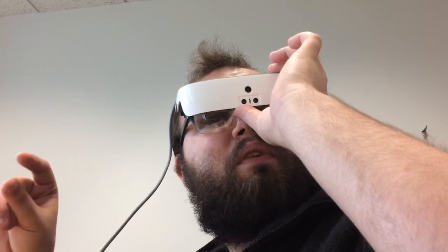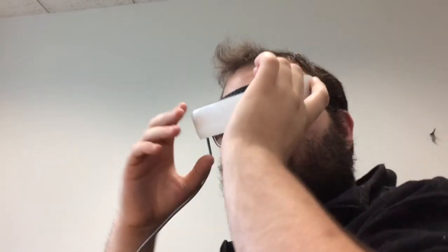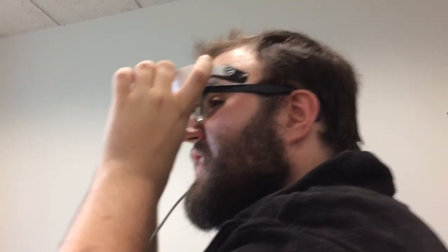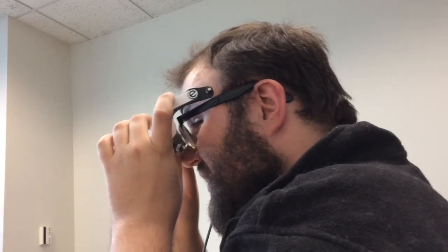The user clarifies that his primary goal with these glasses isn't necessarily for reading — it's more for getting clarity and detail, as he is an artist. When asked about painting or drawing, he specifies he does digital art.